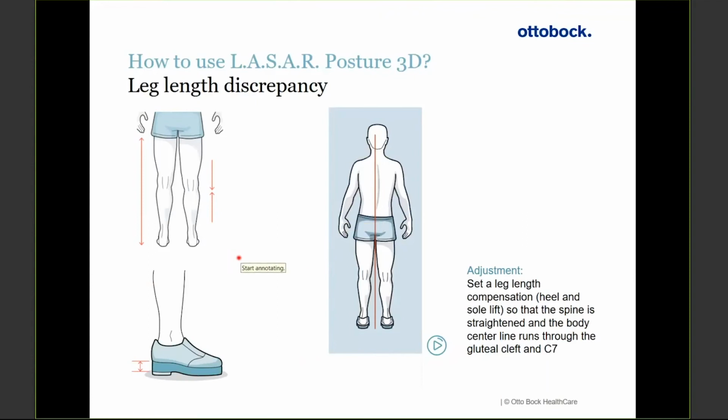So like I mentioned previously, where you can click on the camera button and show in the coronal plane a vertical line. So it's going to project a vertical line on the image of the patient. And if there is a difference, you're going to see that the vertebrae is not lining up through the center of that line. And that's what we want to achieve. So a really nice thing there for leg length discrepancies.